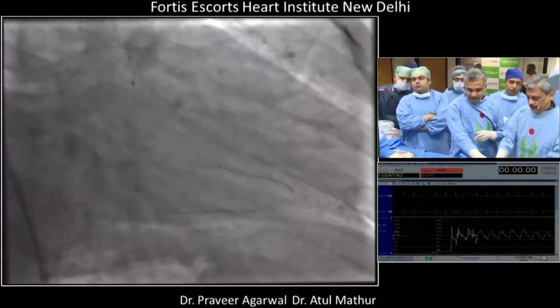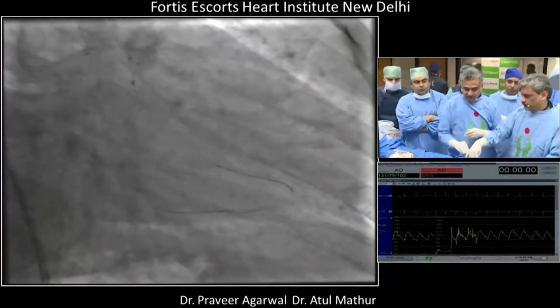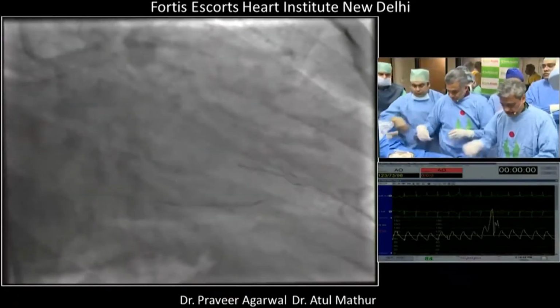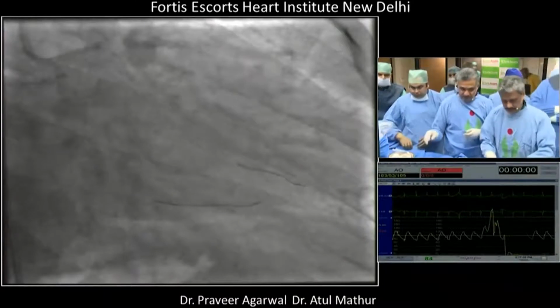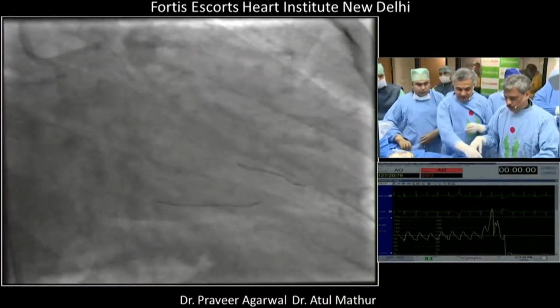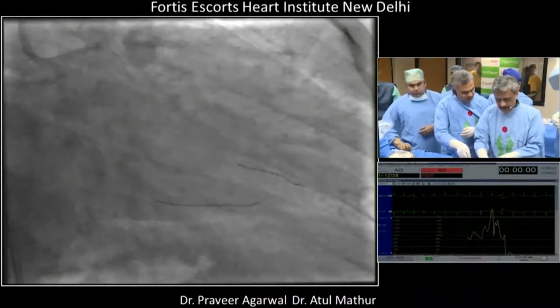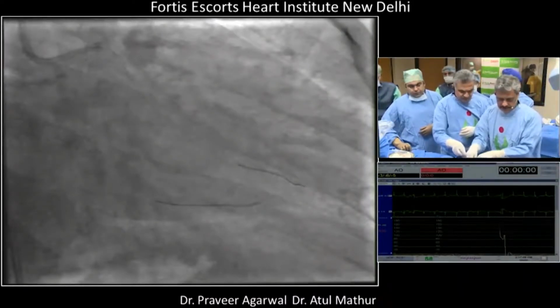So we'll take the 3, put this first in the circ, and see if we can soften up the bed. So what we'll do now, we'll change our strategy of taking 3 down first. No, we'll do 2.5 first, and then we have this ready, prepared. Okay, you can try and go put this in the circ.